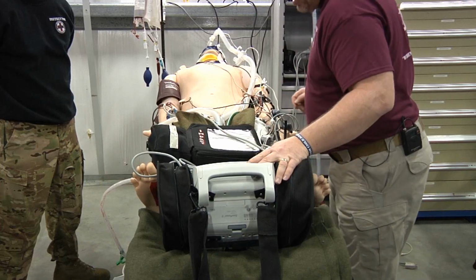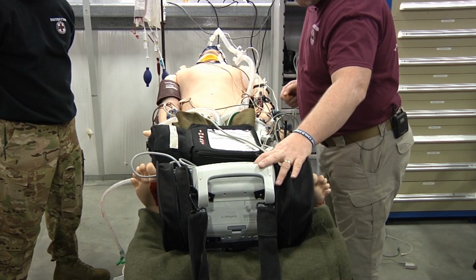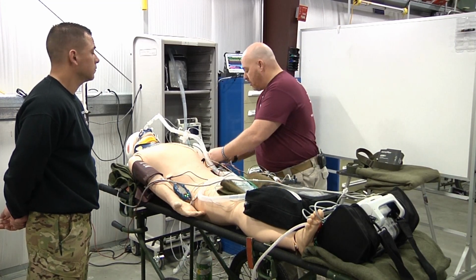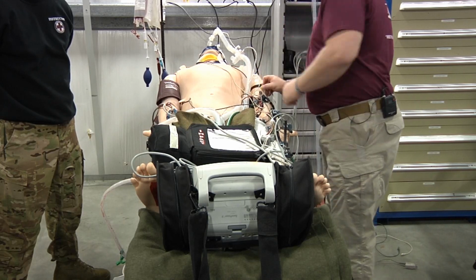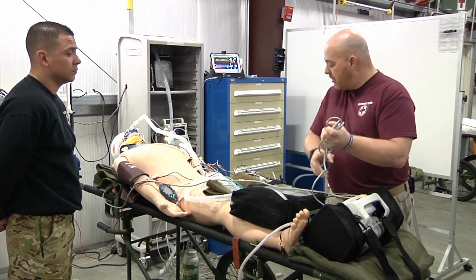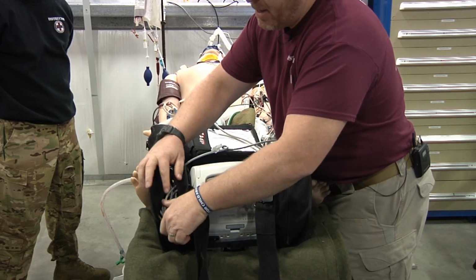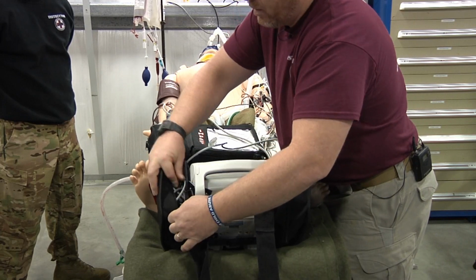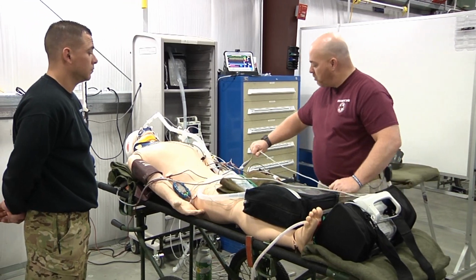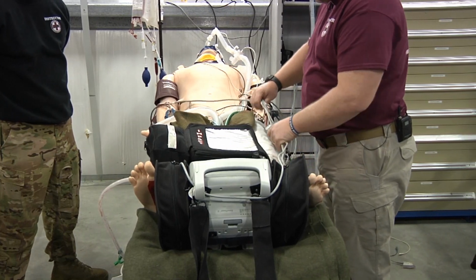P1. Now before I zero, I'm going to close it off to the patient, open it to atmosphere. I'm going to hit 0. It says zeroing. Once it's zeroed, close it off and open it back up to the patient, and I'm getting a correct reading so I know that my pressure line is zeroed. Take all of this excess cable, put it back in the bag. Now if you wanted to go ahead and put all this stuff with your other cables, you can do that as well. All right. That way everything is down and connected with the patient.